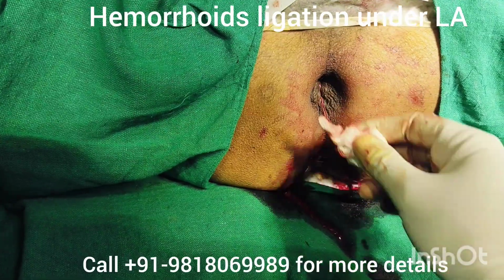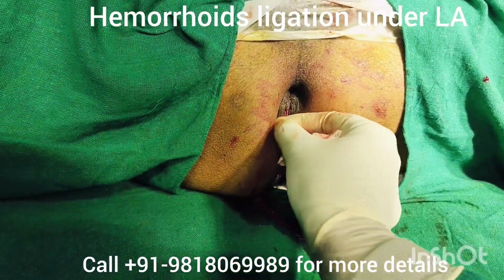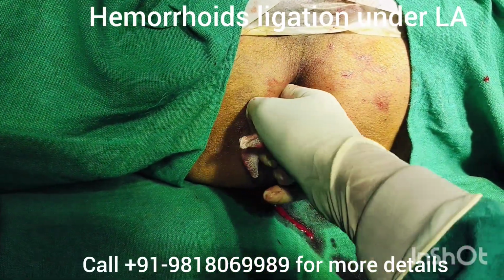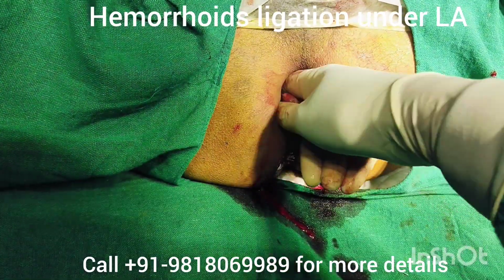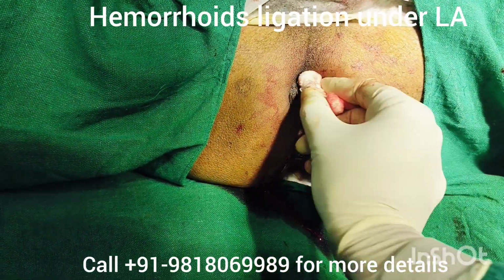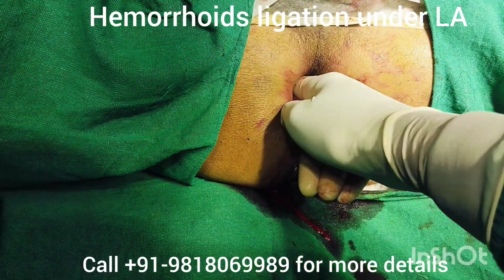After mopping, I will apply Allis forceps at mucocutaneous junction at 3 o'clock position. Then I will hold the pile mass at 3 o'clock position through piles clamps.